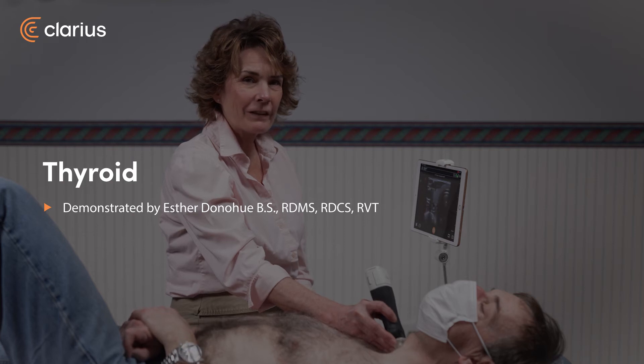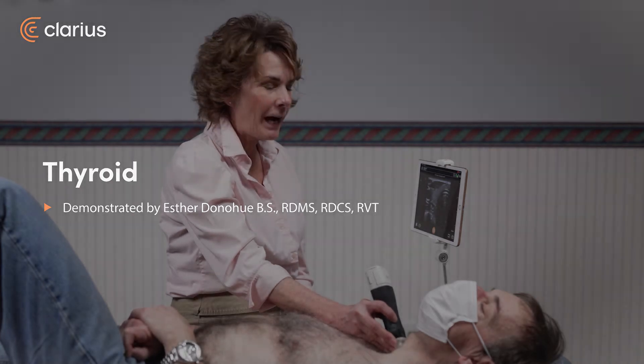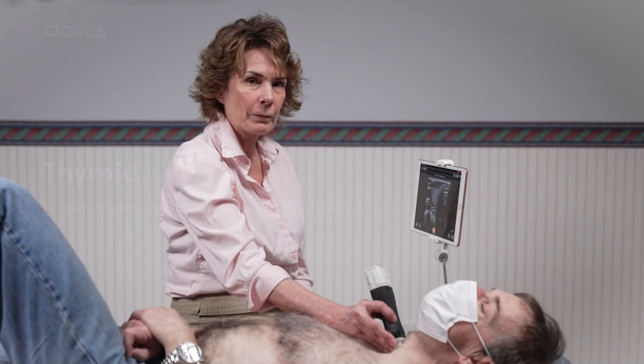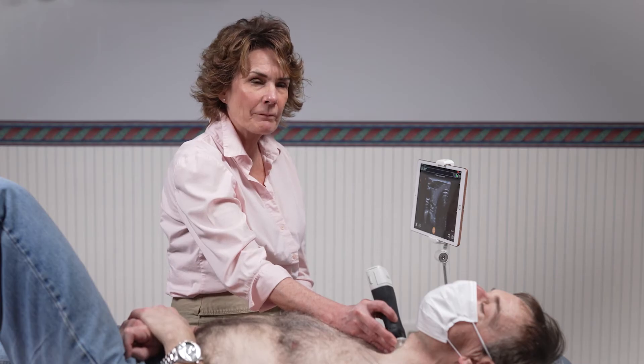Hi, my name's Esther. I'm going to be showing you how to do a complete thyroid exam today.